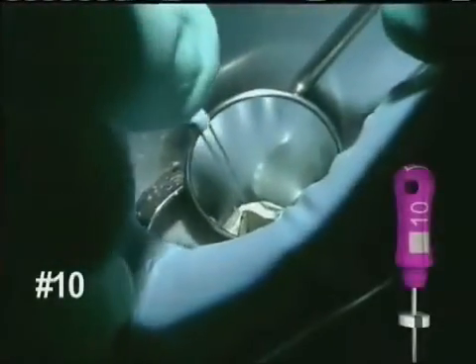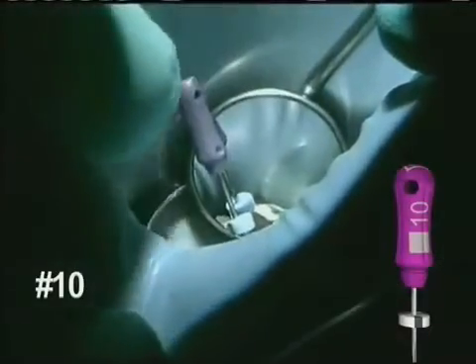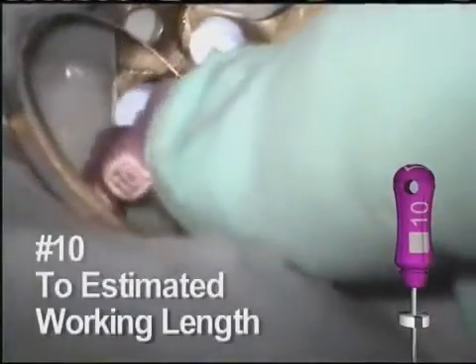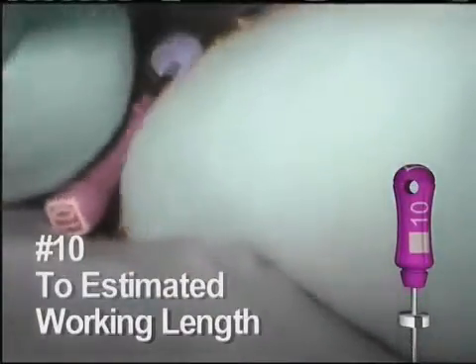After the initial coronal shaping, the number 10 hand file is reintroduced. The 10 is negotiated to the estimated working length and gets to length quite easily here. Because of the coronal shaping done with the earlier instruments, this hand file will normally engage in only the last few millimeters of the space.